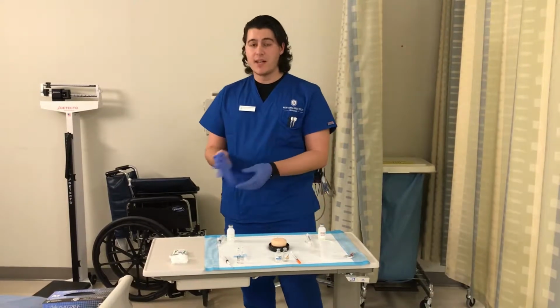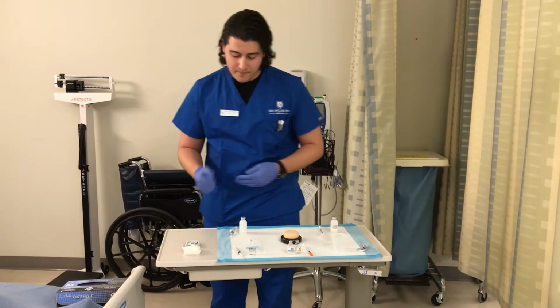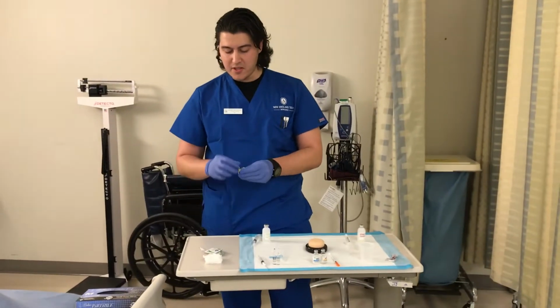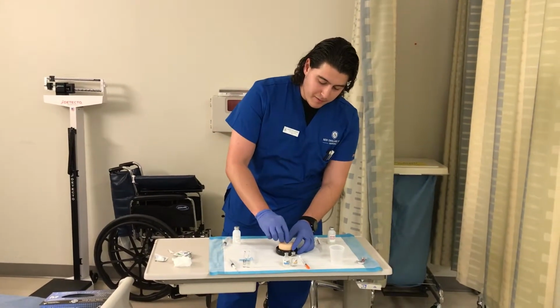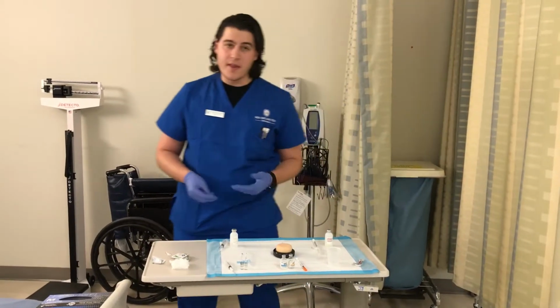With any injection medication, you always have to clean the spot first. Once you select it, you have to clean it. So the first thing I'll do here is take an alcohol swab, and this is going to go for all of them. You want to clean from the center outside of the spot and let that dry, and then that'll be good for any injection.